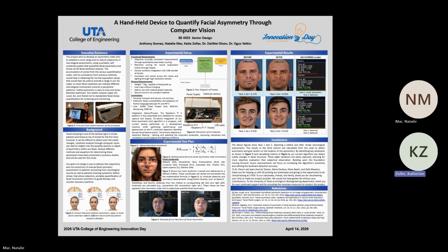For our physical requirements, we want this device to be around 3 kilograms or less, basically being able to be held up with one hand. It should last a day without charging. We don't want it to rely on charge too much. And then again, just safe in the clinical environment. For our constraints, our budget is $1,000. We've used about half of that. For our software, we're using Python, and for our housing, we are using 3D printing. We want it to be secure.